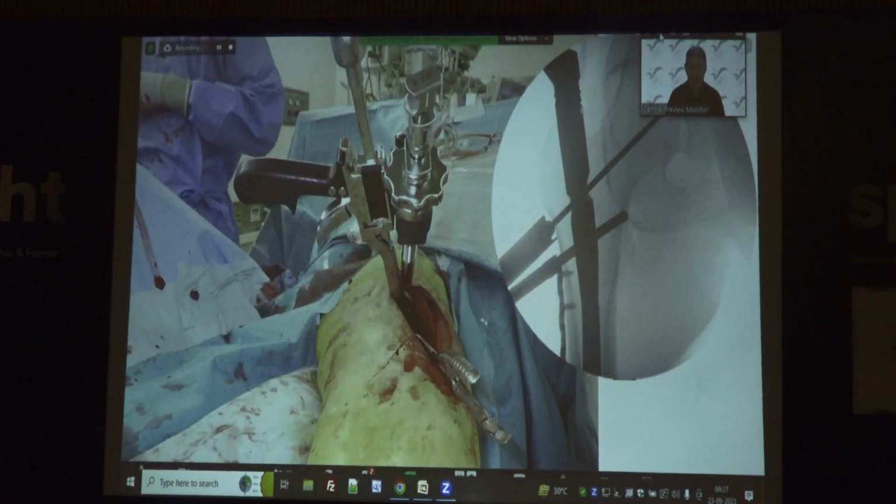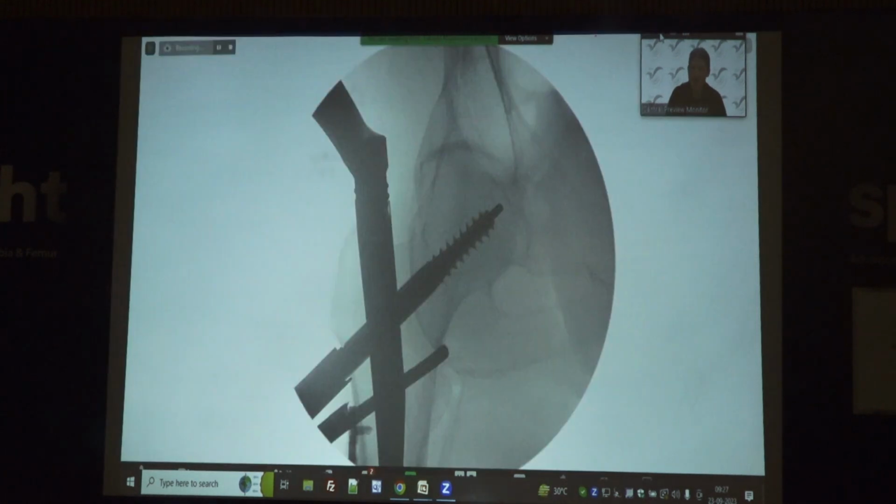So here's my collinear clamp and the drill guide jig that goes together. There's not much place that I can control with my guide wires, but you still can play with it, and you can get the reduction by keeping the collinear clamp inside too.